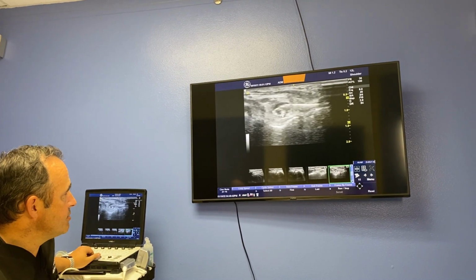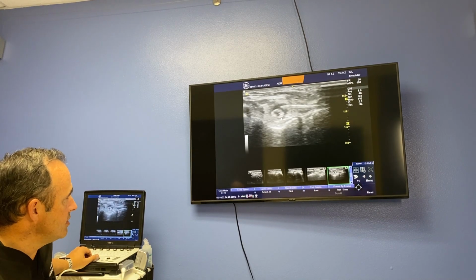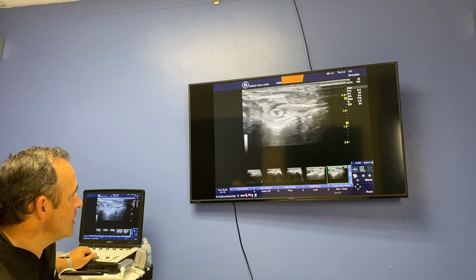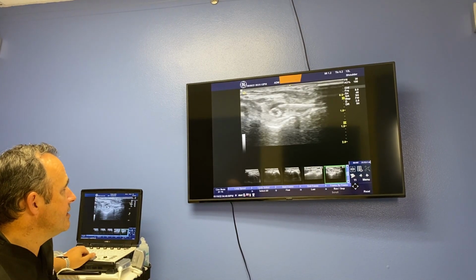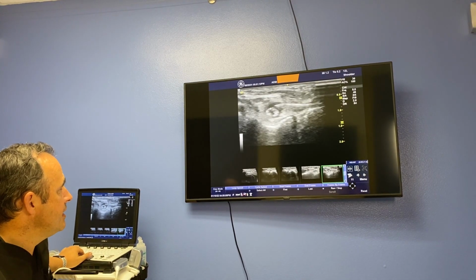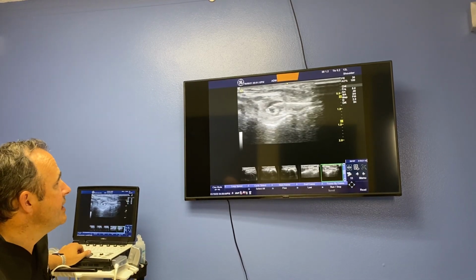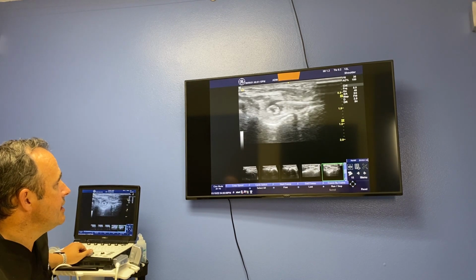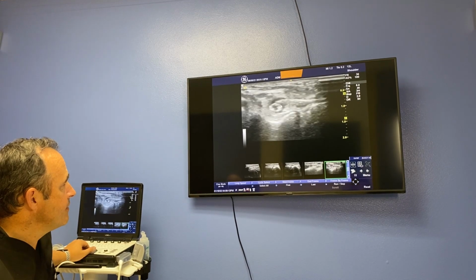This is on a video loop, so you see the needle kind of. What's happened is we had the needle down below the nerve. This is actually the C6 nerve root. This is the C6 transverse process. So this is in the front of the neck, and you can see how we've created this gap of fluid on the bottom side of the nerve and the top side of the nerve. In this case, this is the nerve root. So that effectively decompresses the nerve and allows the nerve to move more freely throughout the neck.